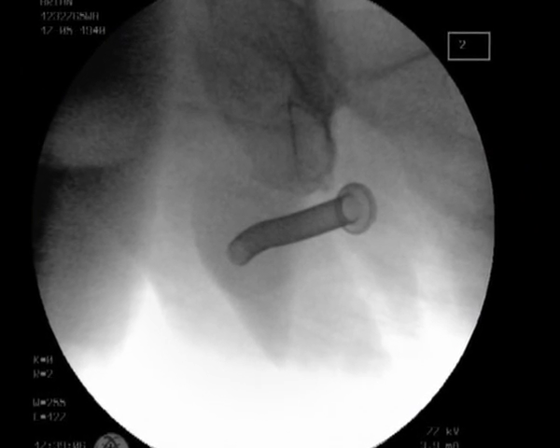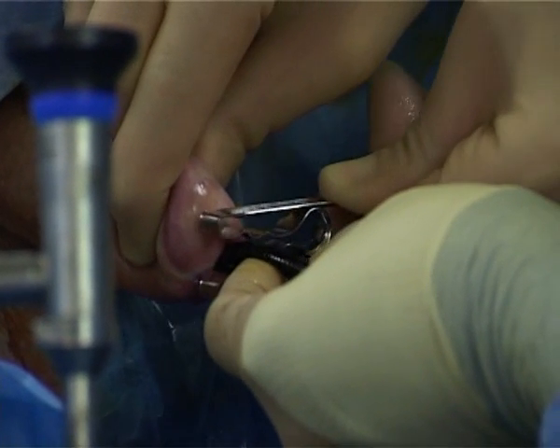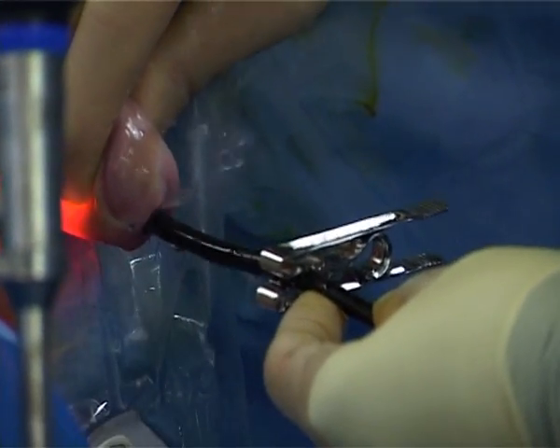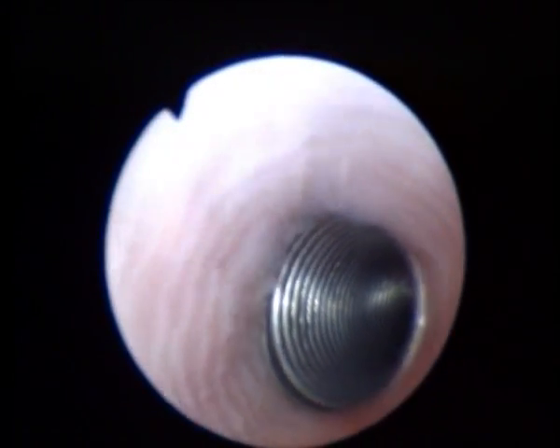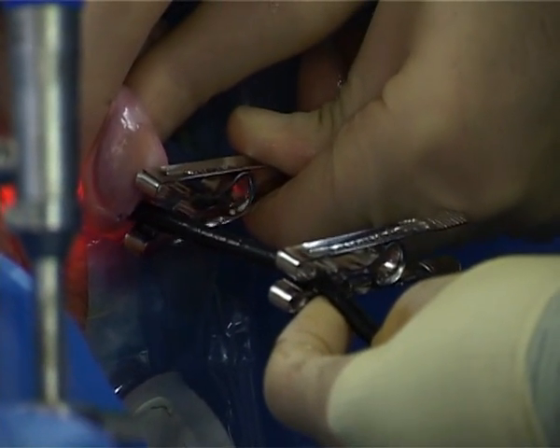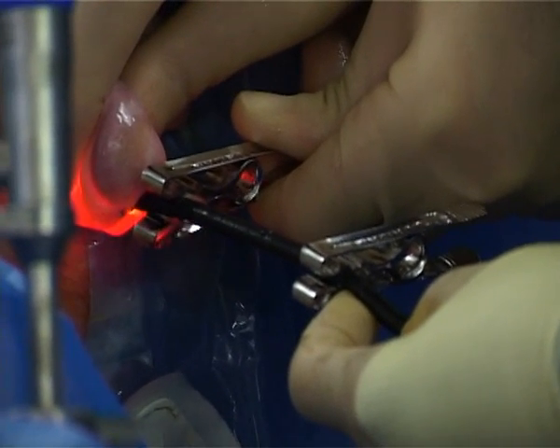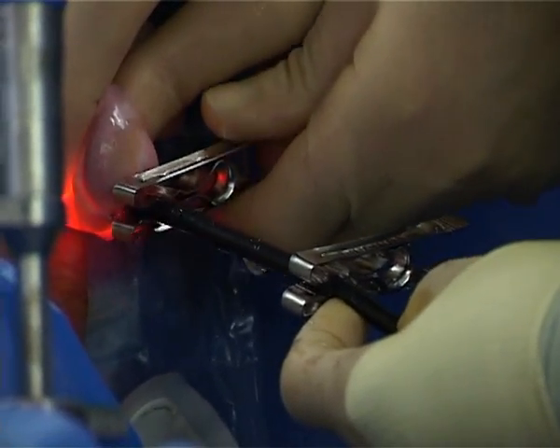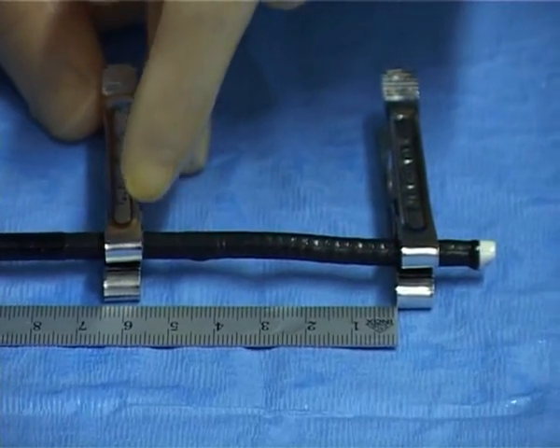Image intensifier shows the remaining proximal Memocath. The flexible cystoscope is then marked with 2 clips to accurately measure the desired length of the distal Memocath. The clips mark the distance between the distal end of the proximal stent and the meatus. The correct size of Memocath 044 stent is then selected.